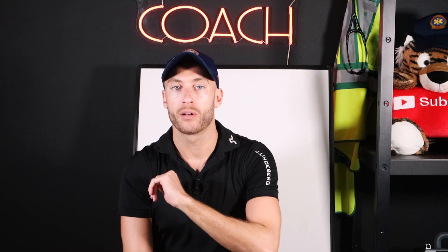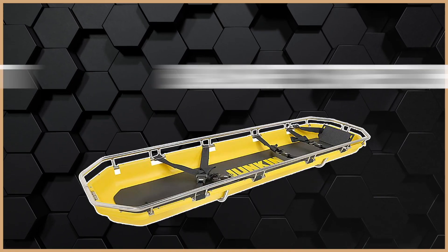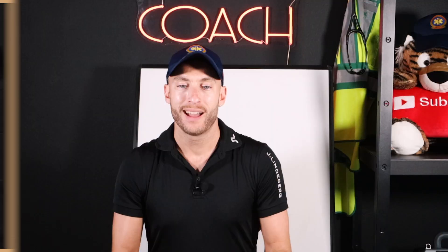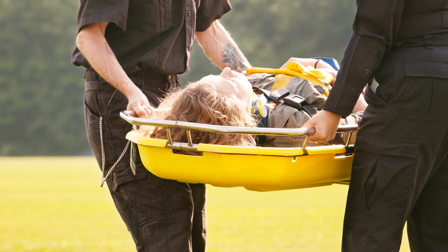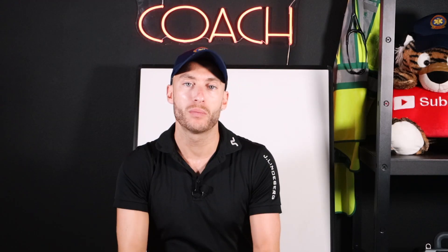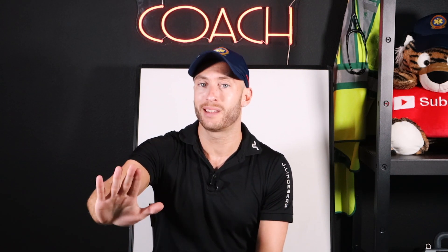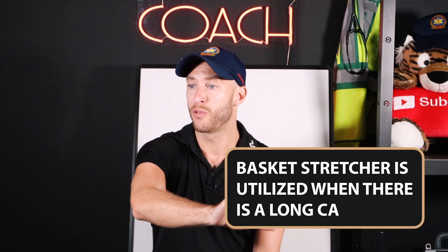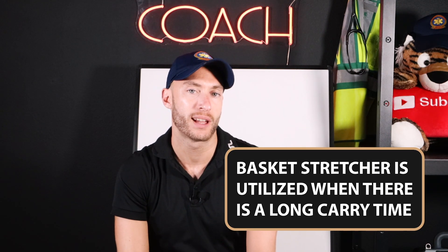The other device used in EMS and also with fire departments and rescues — some may call it a Stokes basket, but for this video we're going to call it a basket stretcher. It has a little more weight and more bells and whistles. It can be slung up in the air for rescues. This basket stretcher is really for moving the patient through a very long or difficult environment, and in that case you might want to use that stretcher.